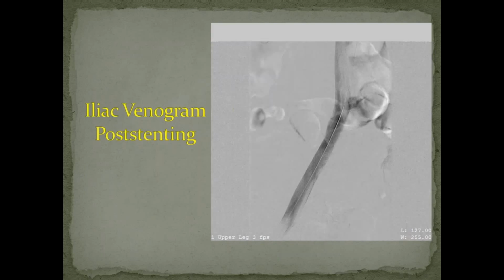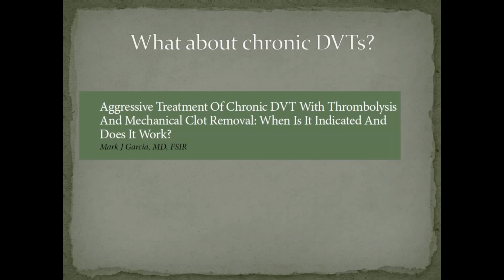So this is just the iliac venogram post-stenting showing complete restoration of otherwise previously occluded left iliac vein. And again, the patient's symptoms very quickly decompressed, and he did much better.